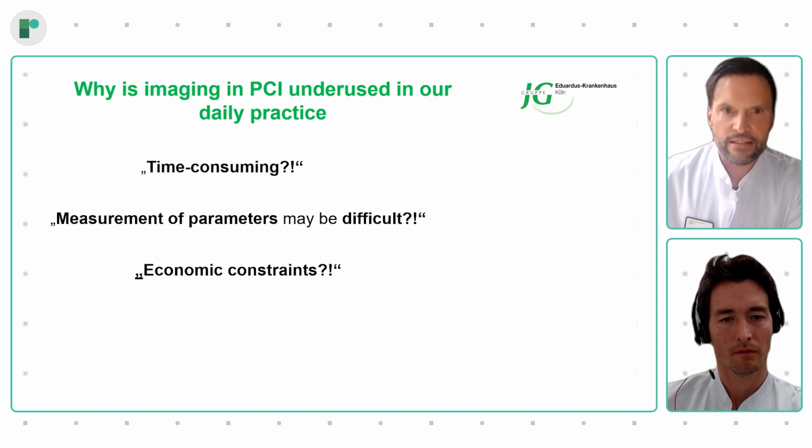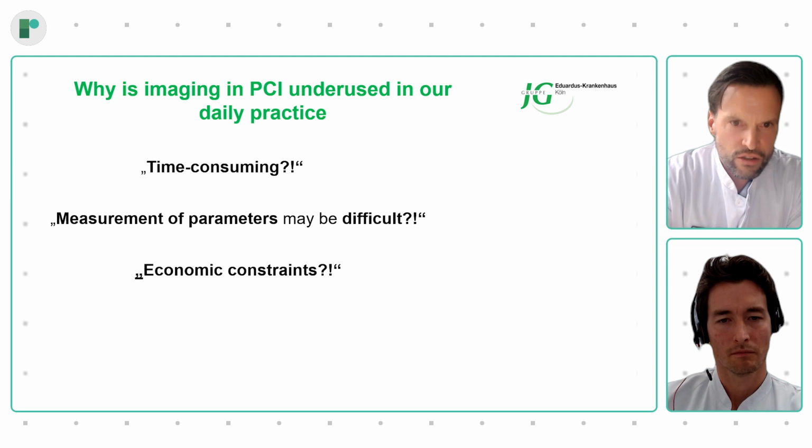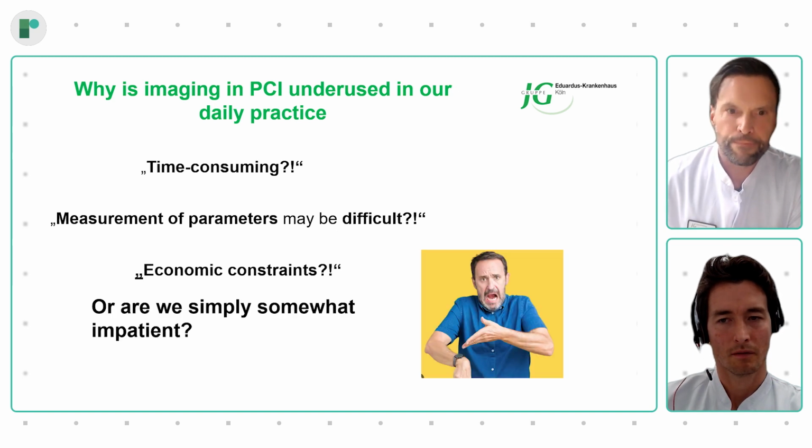What are the reasons why intravascular imaging is underused in daily clinical routine? I would say there are some prerequisites which are not really true. If we talk to our colleagues, they always tell us it's time-consuming, it's difficult to use, the measurement of the parameters is sometimes not clear. There seem to be some economical constraints, which are definitely not true, at least in Germany.